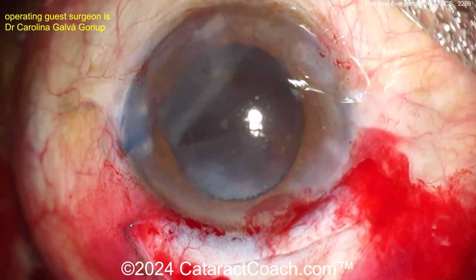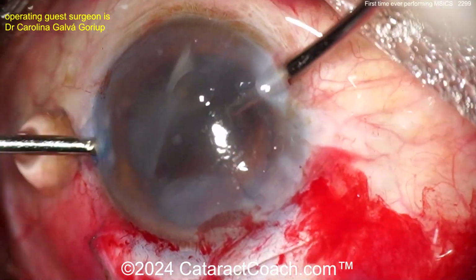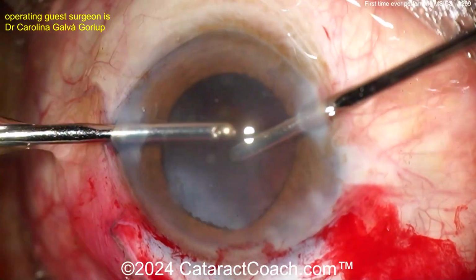Cortex removed. Now you have incisions. You can do a coaxial through your corneal incision there, or you can do bimanual. Here's bimanual. Very nice, very easy. Cleaning up this cortex. The rest of this case is going to be fantastic. You can definitely learn this.